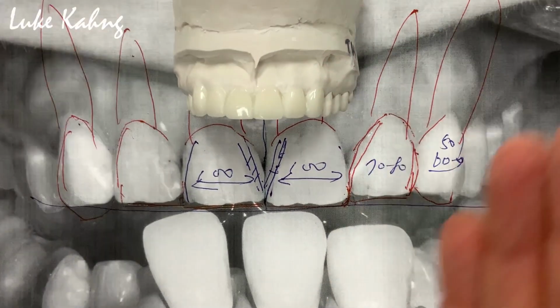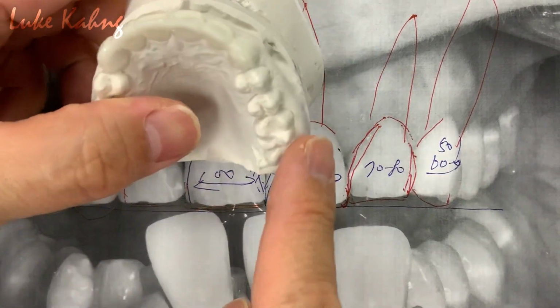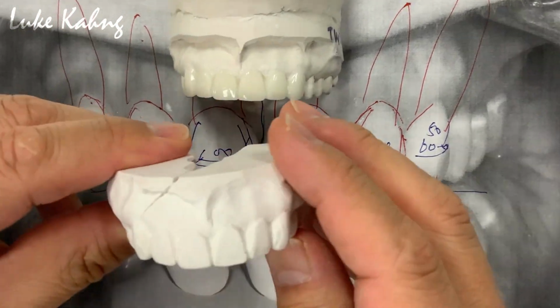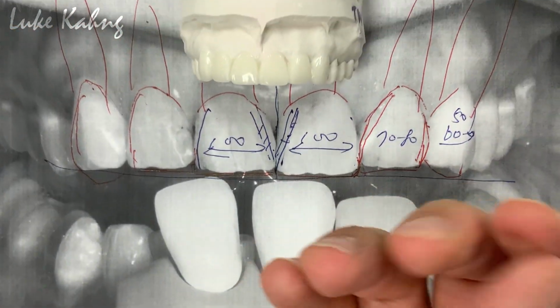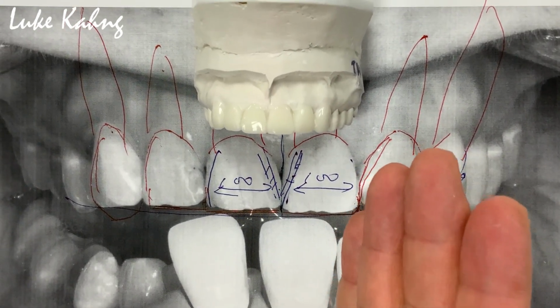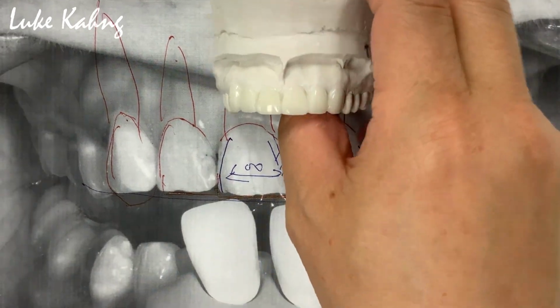We make the wax after I prep it, wax contouring, and then we duplicate it, and then make a stent and send to the doctor, so the doctor can make the temporizations. So temporarily they can discuss together what they like about the size-wise and canine, lateral, those kinds of things.